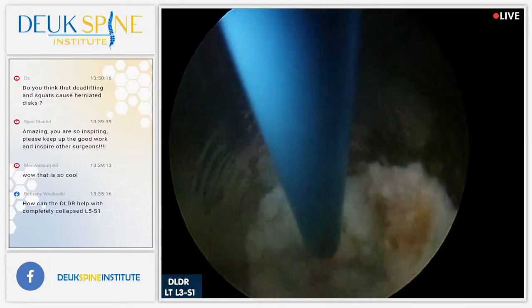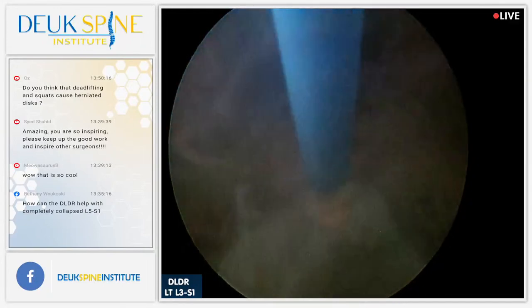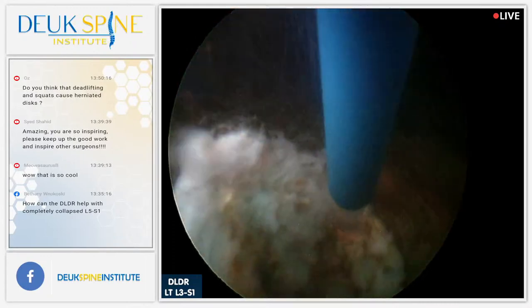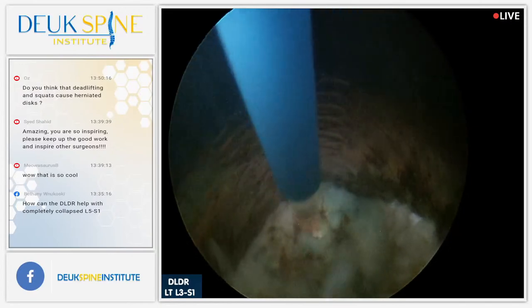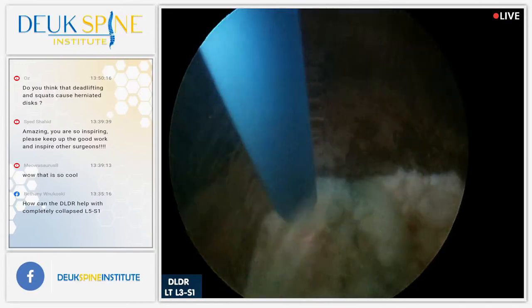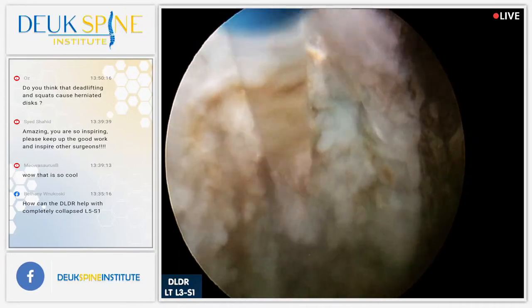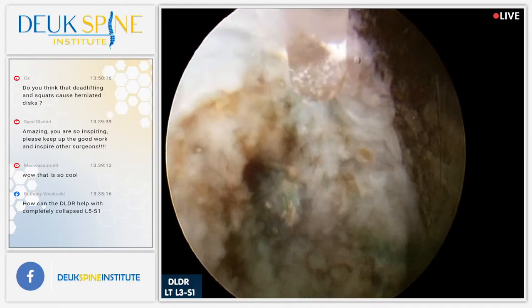So the inside of this tube is around 5.5 millimeters, about 5 millimeters from side to side. So it looks like a big space, but it's not a big space. It looks like a lot of disc, but it's not a lot of disc, really.